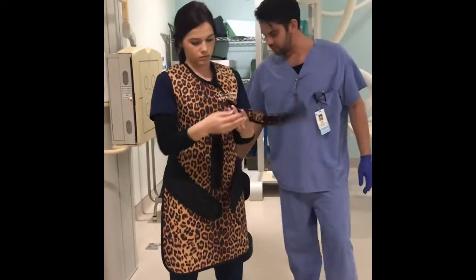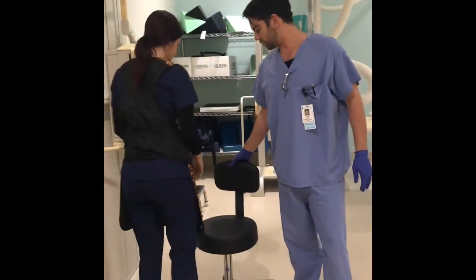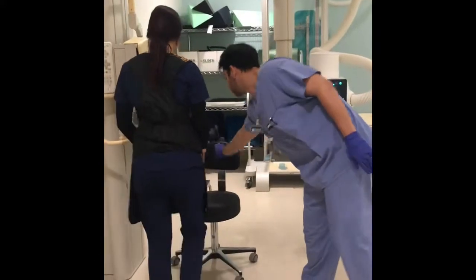Okay, now if you'd like to have a seat, we're... This one? No, not that one. That one might block out some of the lower sinuses. So if you'd like to have a seat right here.